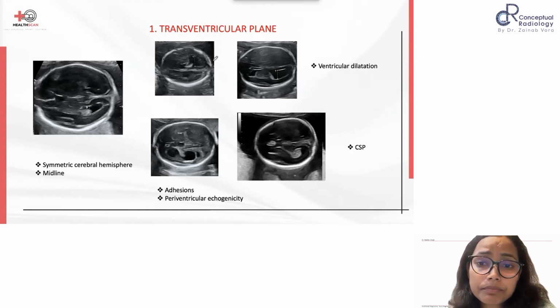And then as I was telling, we should measure the other lateral ventricle as well, because of the artifacts of the calvarium, we are not able to see the near field lateral ventricle.